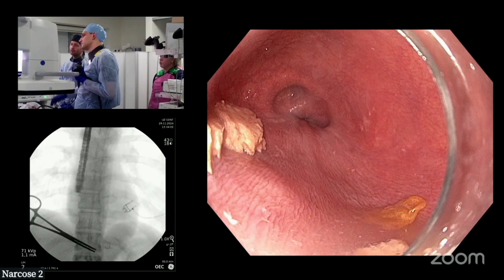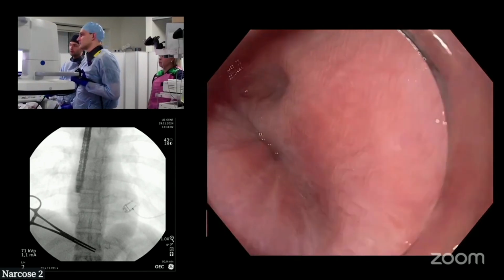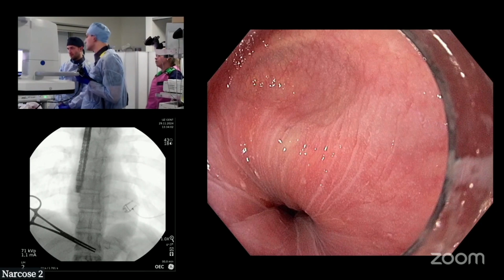So should we have a look then? Yeah. Let's define the anatomy, pretending we're doing Barrett. So let's go and look for the, it does seem to be relative. There's a bit of a diverticulum there, even, isn't there? Just above. So at 12 o'clock, you see a small forming diverticulum, and you see quite a developed something there.